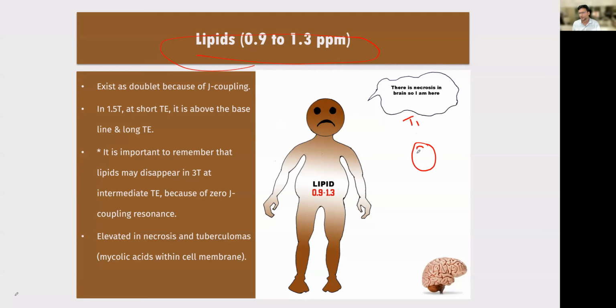In the tuberculoma, the periphery will be hyperintense, attributing to the deposition of mycolipids. So that is one condition where you get elevated lipid lactate. Similarly, there will be lipid lactate elevation whenever there is a central necrosis in a GBM or a metastasis. Even in tuberculosis, sometimes there will be elevation of choline when there is a high cellular turnover without necrosis in early phases. So what I'm trying to tell you, the pathology, but definitely the ratios won't cheat you.